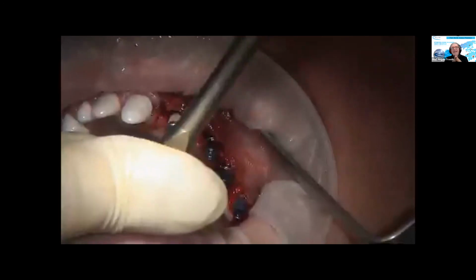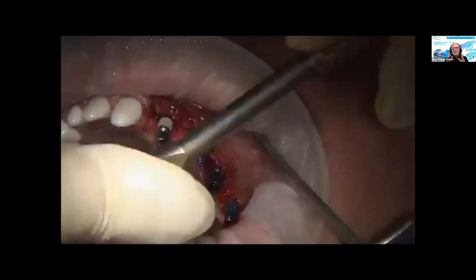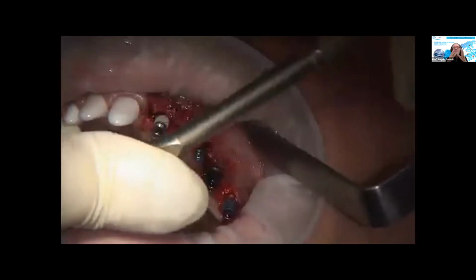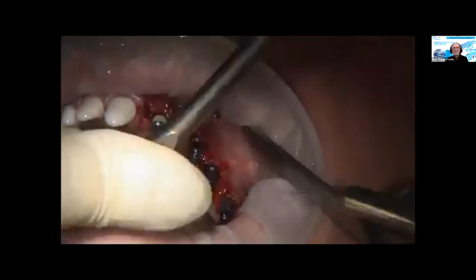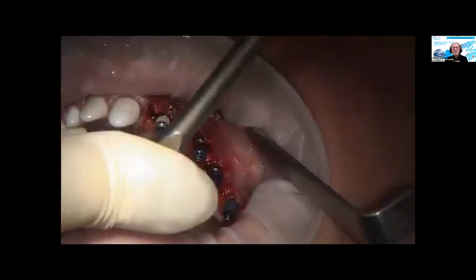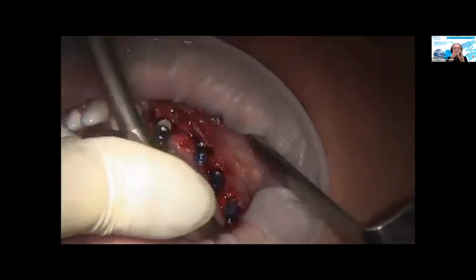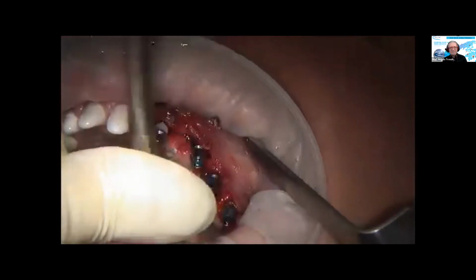And once again, as you can see, an experienced implantologist knows how it looks when someone else is screwing in implants and he needs a lot of force. So the experienced implantologist might agree now that you can see this is really Newton. Actually, of course, we took the measurement.